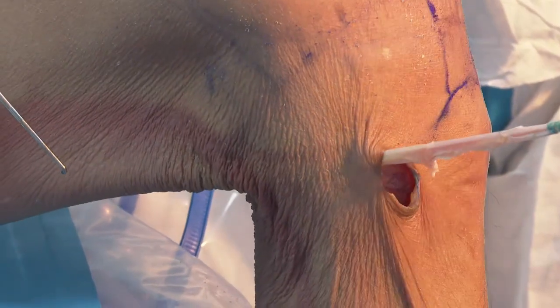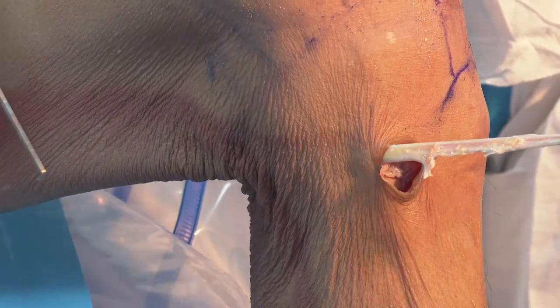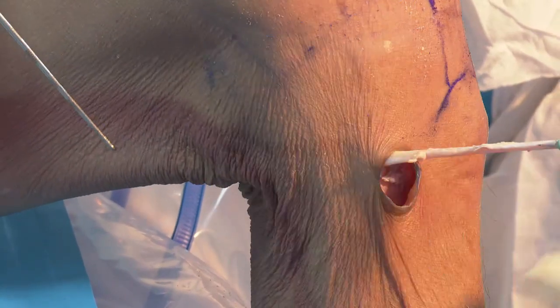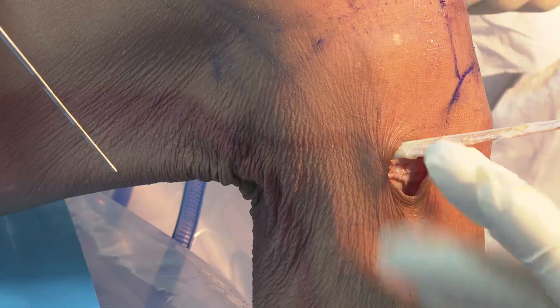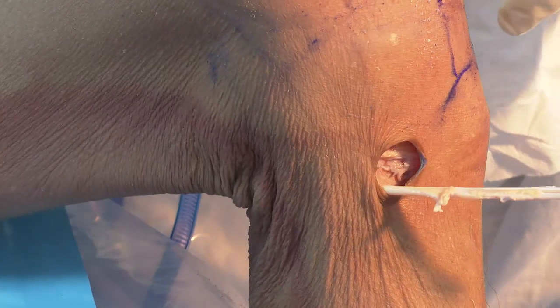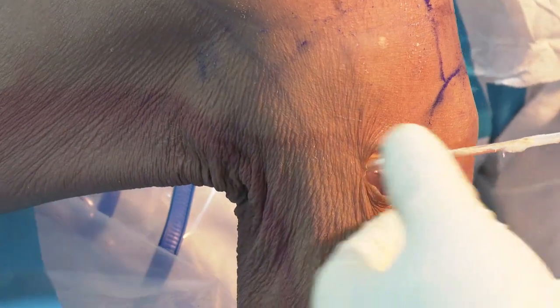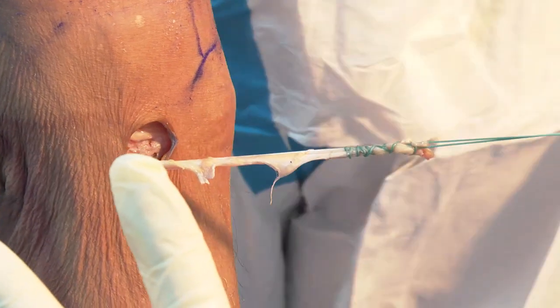So the branch is always on the inferior side. There's no branch on the top. It's only a branch under the tendon. The branches are all below the tendon, okay. Not on the top, the proximal side. Yeah, and now there's no more branch. We can harvest. Now it's all cleared. On the semitendinosus, most of the time there'll be two branches.